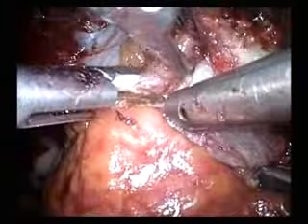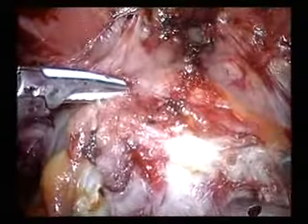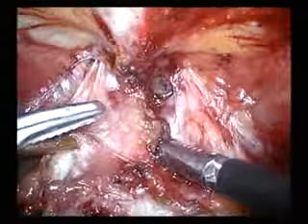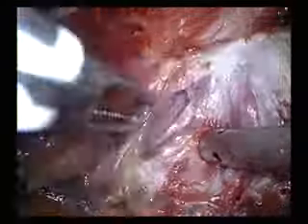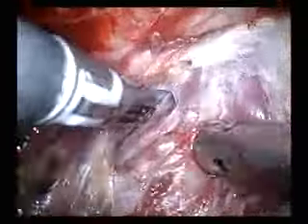The incision is performed on the left side from the bladder neck toward the apex. A plane is developed between the prostate and its thin overlying periprostatic fascia. This maneuver is performed medially to the puboprostatic ligaments, leaving intact the puboprostatic ligaments, the periprostatic fascia, and the lateral part of endopelvic fascia as a continuous structure.